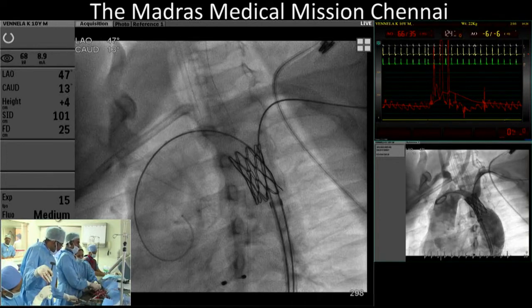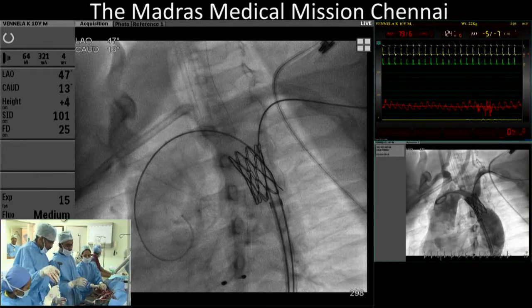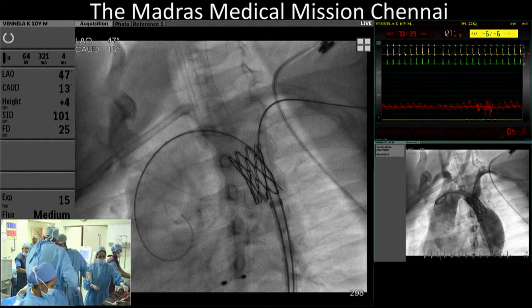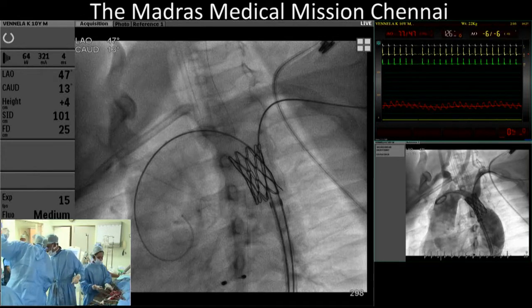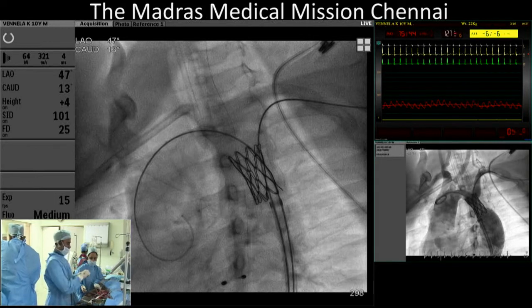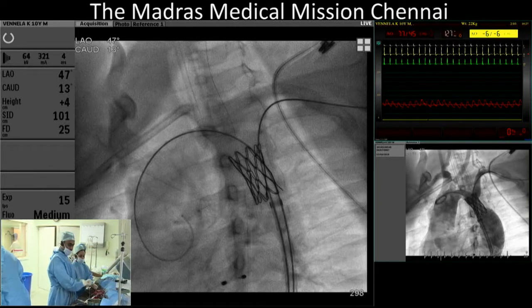Dr. Mario, I don't like that distal flaring at all, and especially in a Turner syndrome, where if I create a descending thoracic dissection, absolutely. So I don't like the distal flaring. We don't have to forget that this patient has a Turner syndrome that theoretically has a higher risk of dissection or rupture as compared to, let's say, normal patients. Yeah. So I will be repeating another arch angiogram.